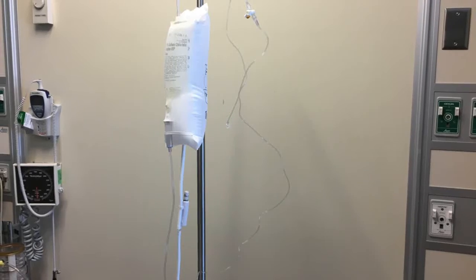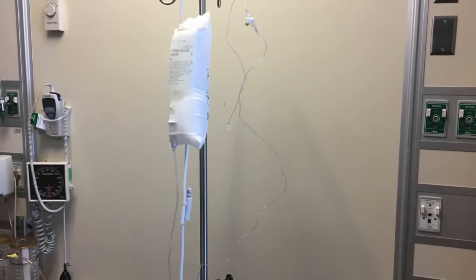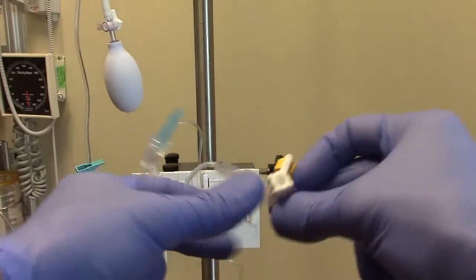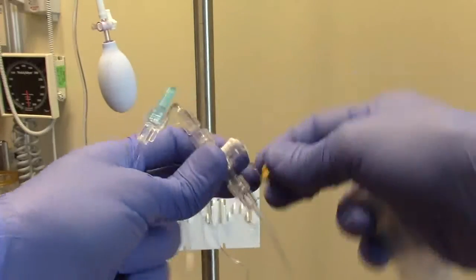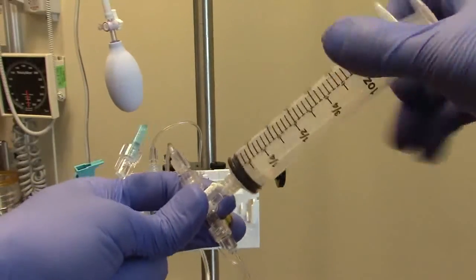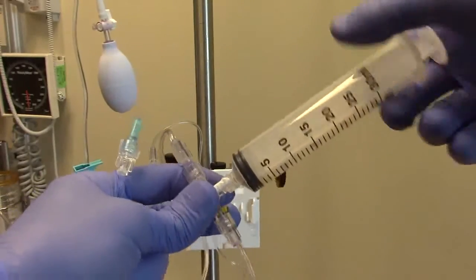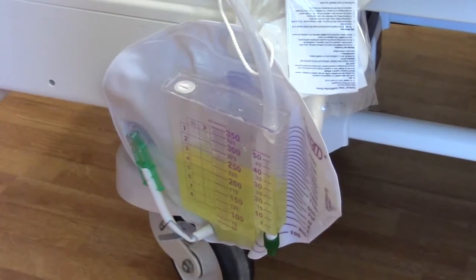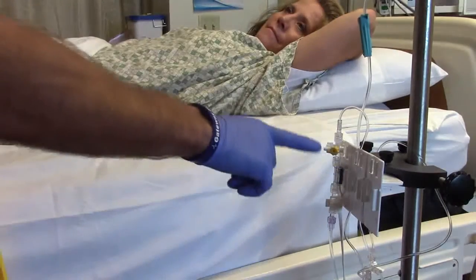Finally, you will need a 30 milliliter luer-lock tip syringe. After complete setup and priming the pressure transducer system, change the label of the line to CVP on the monitor. Then attach the 30 milliliter luer-lock tip syringe to the distal stopcock of the transducer tubing. Your patient should lie supine if tolerated, and the bladder should be completely drained.